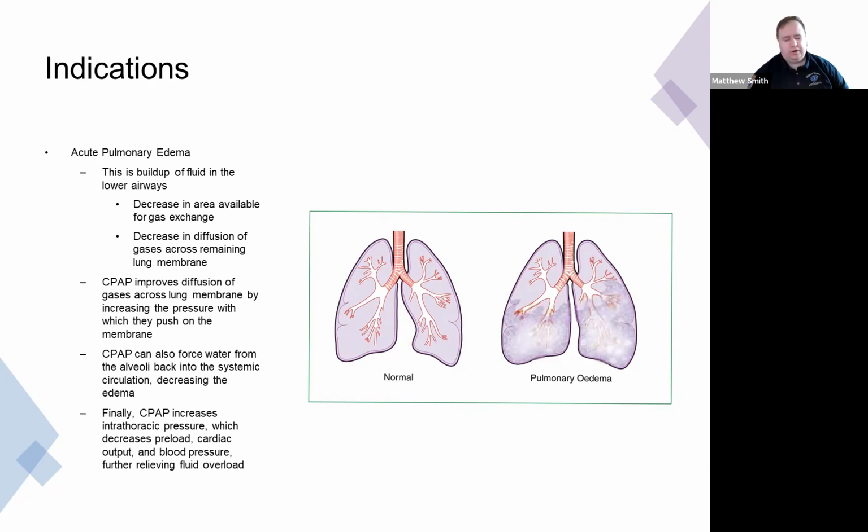But you can also have a patient who is in pump failure that has pulmonary edema due to the pump failure, and those patients can have very low blood pressures. And so those are patients that you can't use CPAP on because of the pump failure and already impaired cardiac output. So you've got to be a little bit careful. But I'm going to tell you that the majority of these patients are not in that pump failure stage. That pump failure patient is a really, really sick patient.